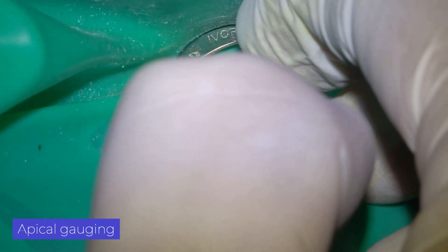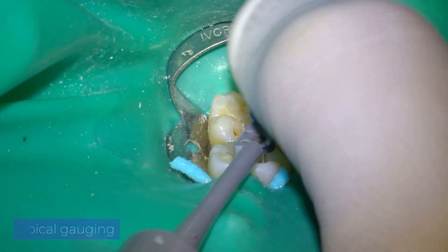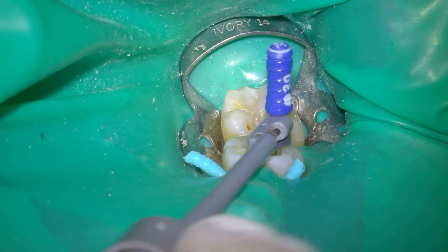In this canal, we achieve an apical caliber of 30. We check with a few taps or small pushes on the file to confirm that it remains fixed, and thus verify our apical stop.